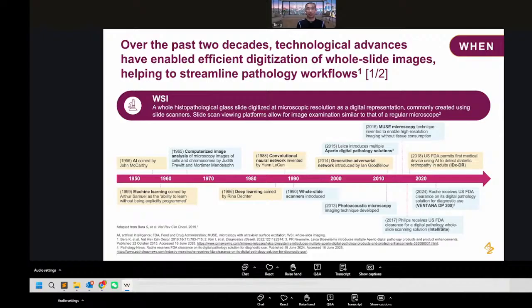All right, this is a timeline with some of the key milestones. It's not exhaustive, so I didn't include everything, but these are some of the key milestones. The blue color is more digital pathology, the digital technology, and the yellowish color is more computational, software-based. So you can see it spans pretty much the last 20 years, or more, right?